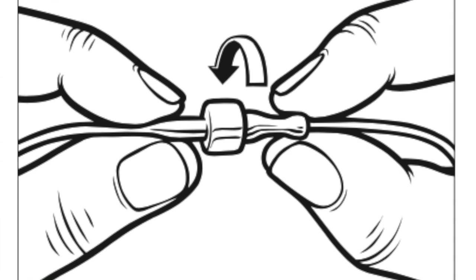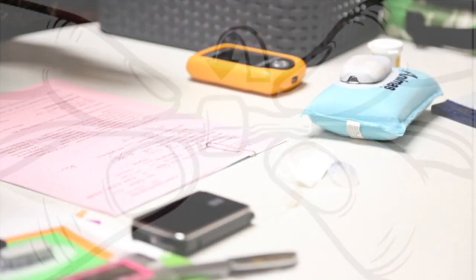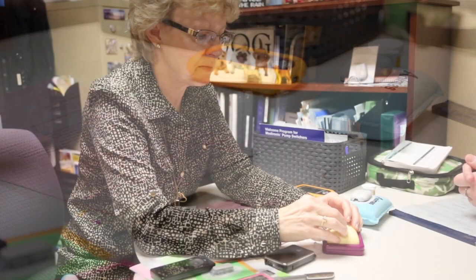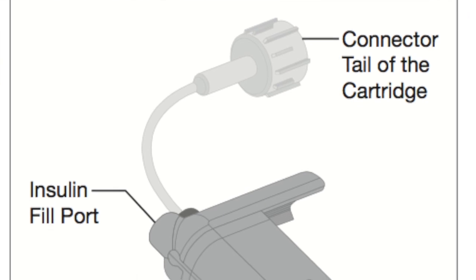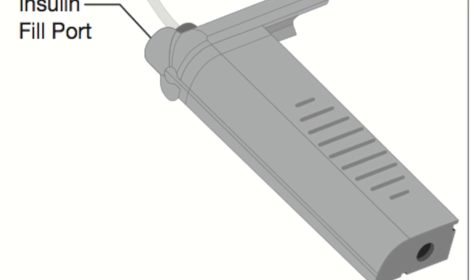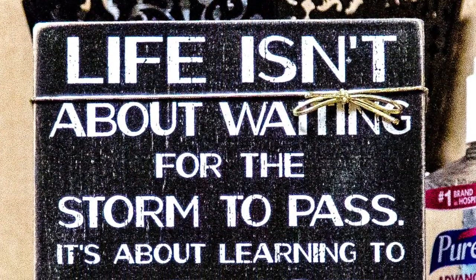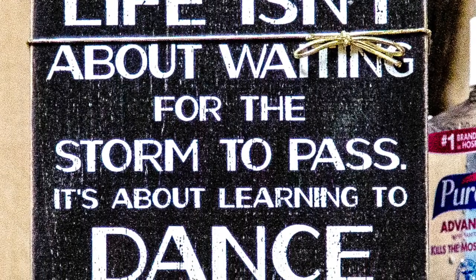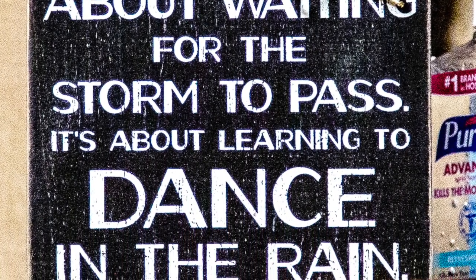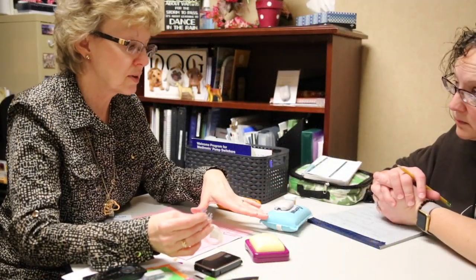Some will find that being able to disconnect, this would be on your body, insertion set here, and with a traditional pump, you can connect and disconnect. That's an interesting thing to remember if we have to go that route. One of the kiddos that I was working with played basketball, and he did not like the feel of this at basketball. It would get knocked off, that sort of thing. He decided to switch after he used it for probably a good year. He knew what he was talking about.